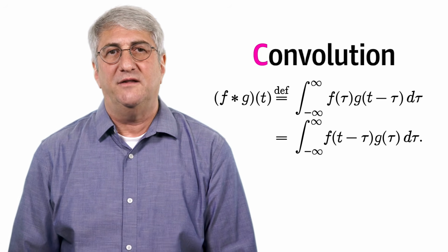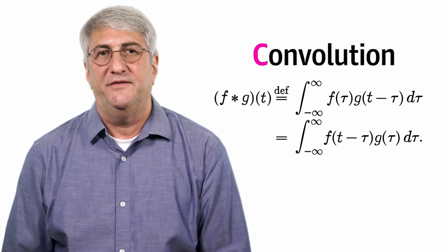"And the way that the CNN looks for these building blocks is the C in CNN, and it stands for convolution. It's a mathematical operation that looks pretty complex. But actually it's very simple. It's a very simple concept. So it's kind of like you've got this filter and you're walking to every part of the image and you're just asking the question, how much does this image look like that filter?"